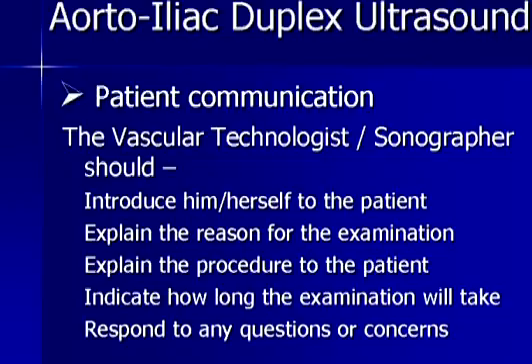As a vascular technologist or sonographer, there are certain things you should be telling the patient ahead of time. First, obviously, you need to introduce yourself to the patient and say, "Hi, I'm Phil. I'm the registered vascular technologist who will be performing your study this morning." Explain the reason for the examination. Why was the patient sent in? What did the physician find that caused this study to be ordered?